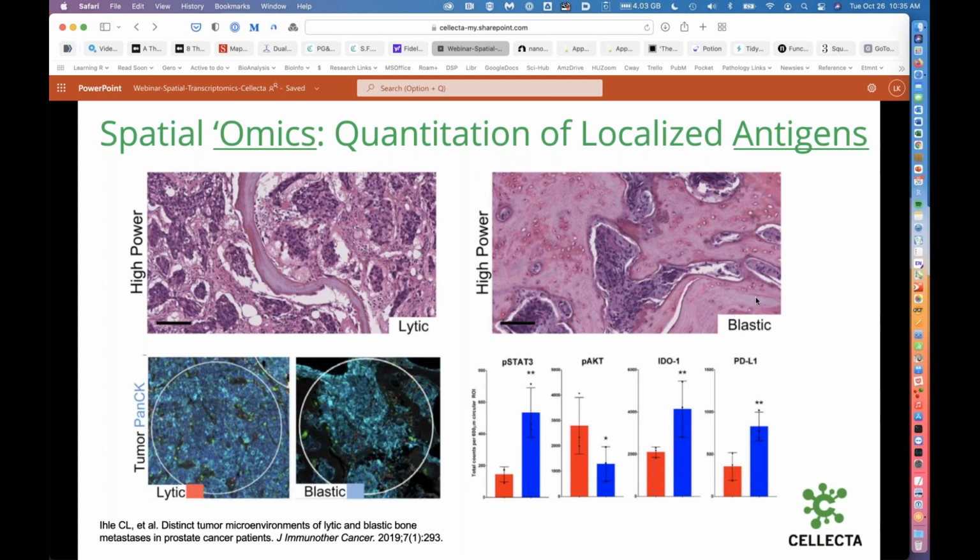In contrast, there's another subtype, also aggressive, which is blastic, a term used for bone-forming tumor. And here, the pink part of the tissue, which is new bone, dominates the picture, and there are some islands of tumor triggering the formation of this bone entrapped in the bone.